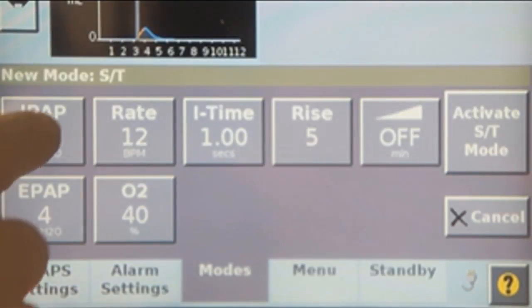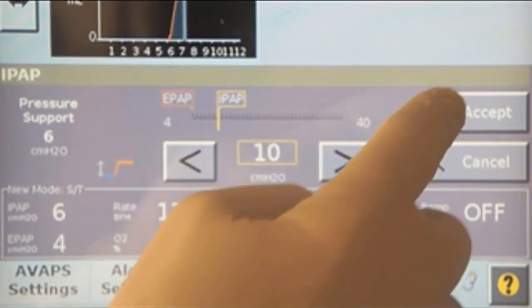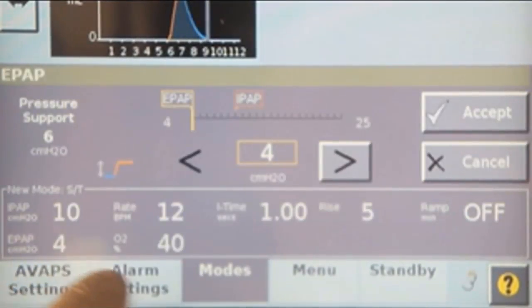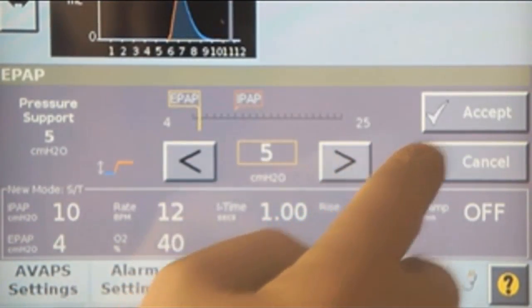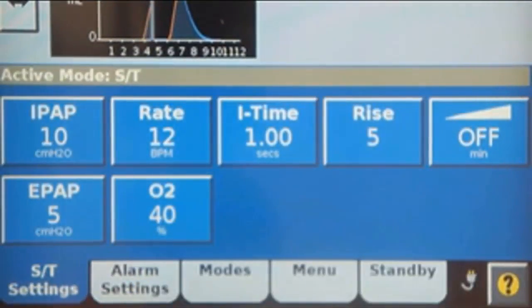Next, enter the initial settings. Start with low pressures and adjust upward as needed. If BPAP is being used, set the initial inspiratory and expiratory pressures to 10 and 5 centimeters of water respectively. Accept the settings to activate the mode.